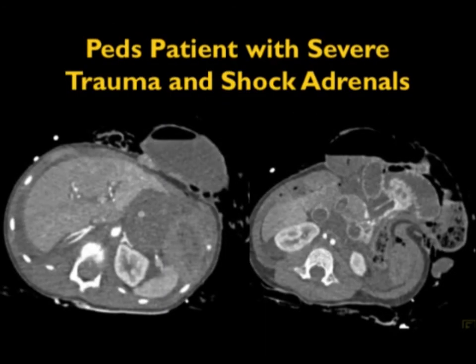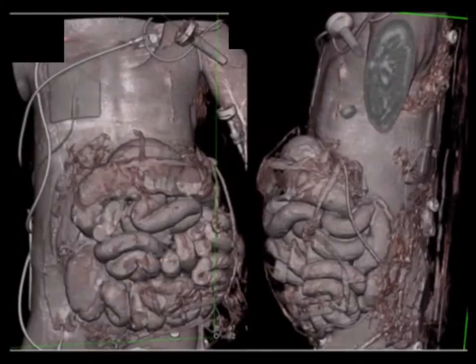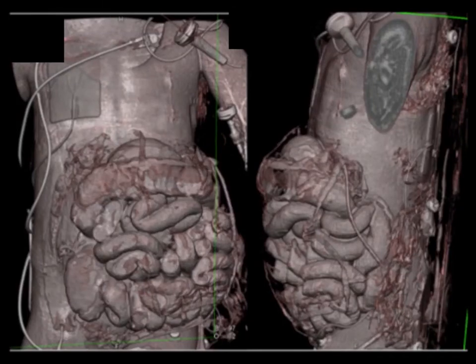When the adrenals enhance very brightly, we're talking about a patient with shock or hypotension. It was initially described in pediatric patients with trauma. This is a PEDS patient with trauma — you can see the rupture of bowel extending through the abdominal wall, and extremely bright adrenal glands, which means the patient is hypotensive and may be going into shock.